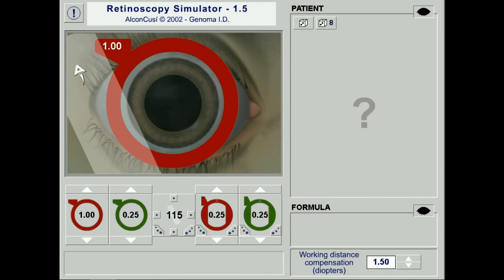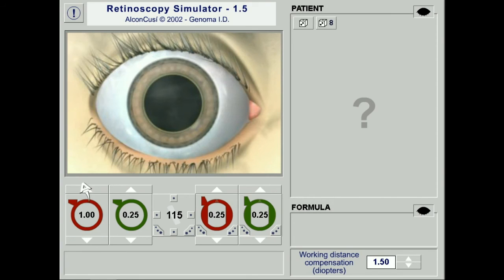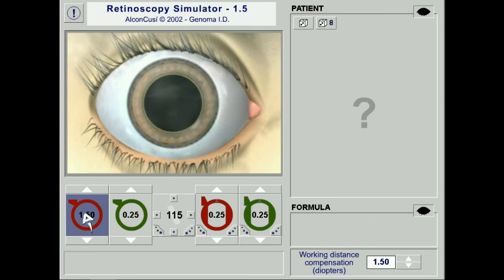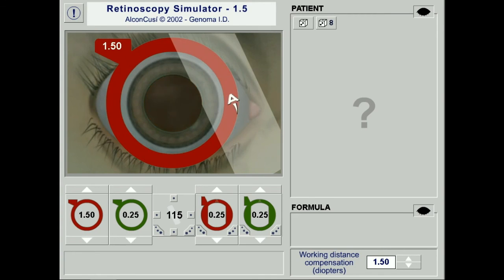As I put in a 1 diopter sphere, the reflex is bright and fast, but in an against movement. When I increase it to a 2 diopter sphere, the reflex becomes a with movement. When I add a 1.50 diopter sphere, the eye is neutralized.